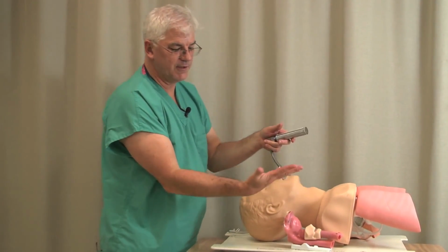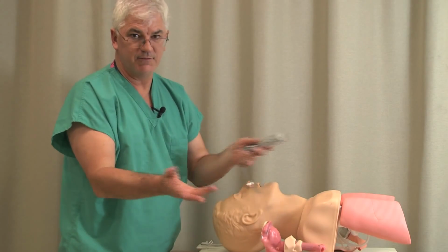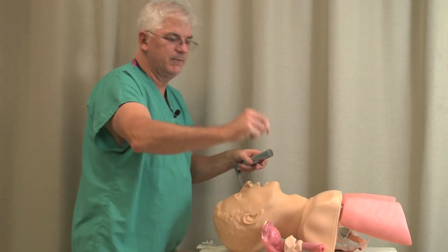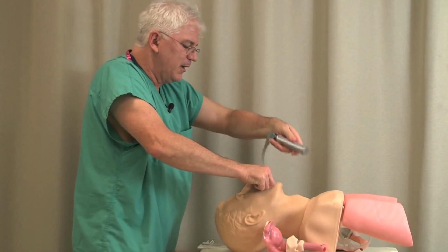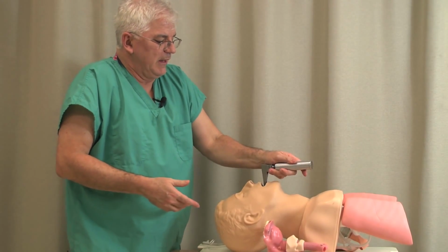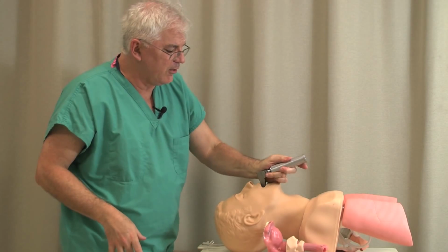So I get his head in good position. By the way, obviously in these and all things I would have gloves on, but just for teaching purposes, not to create a lot of waste. But obviously you would have gloves on anytime you do this procedure. So I can either get the head in good position like this, or I can scissor the mouth open. Notice when I scissor the mouth open, I go like this. It's surprising how many beginners you see will go like this. You can't really generate much energy that way. You scissor the mouth open like this, and put the laryngoscope to the right of the tongue. Put it way to the right. Again, in beginner mistake land, you sort of put it in the middle and the tongue is always sliding over, getting in your way. Put this really all the way to the right.